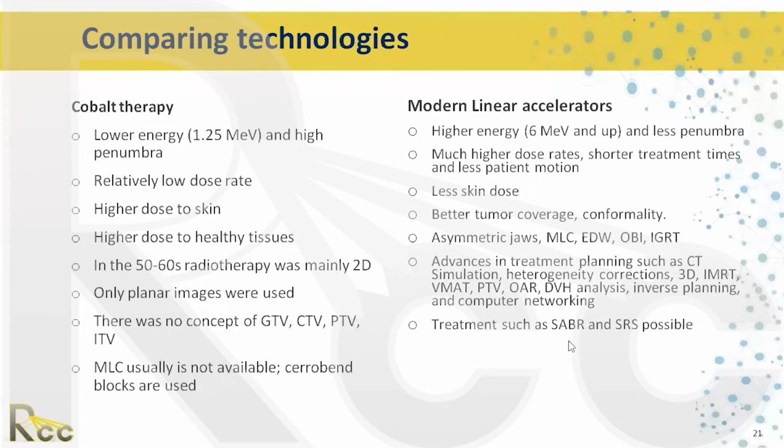And it also allows for treatments which are very, very high dose. Those treatments are called SABR, stereotactic ablative body radiotherapy, and stereotactic radiosurgery, where the dose is given all in one fraction.